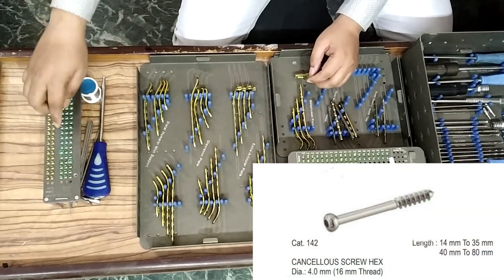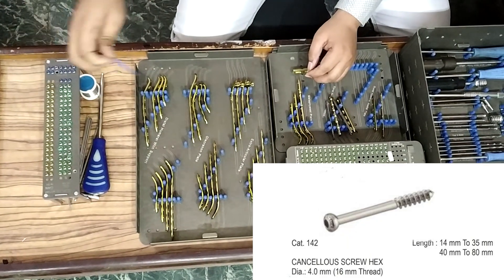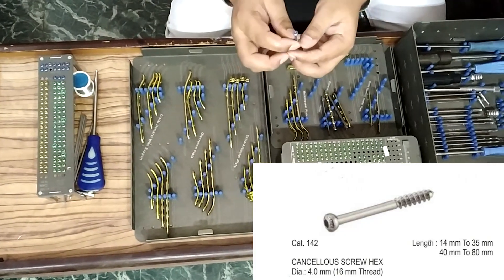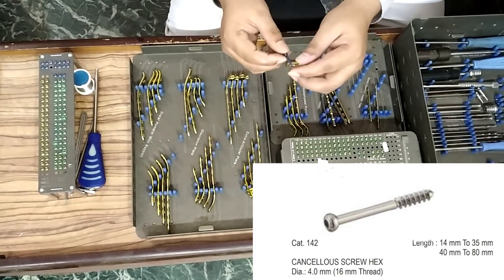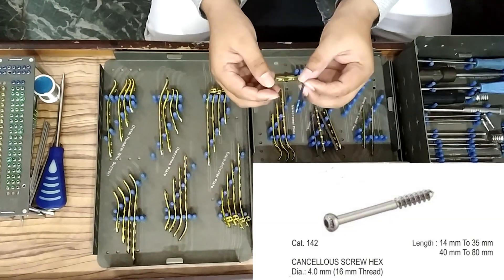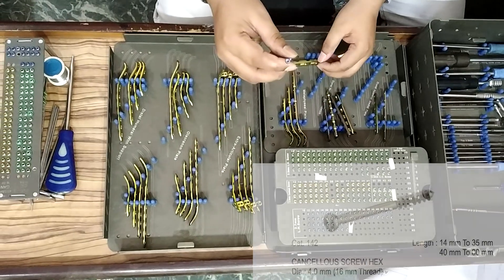4 mm short thread cancellous screw, 20 mm to 60 mm, one piece each. From 20 mm to 30 mm the gap is 2 mm, then from 30 mm the gap becomes 5 mm.